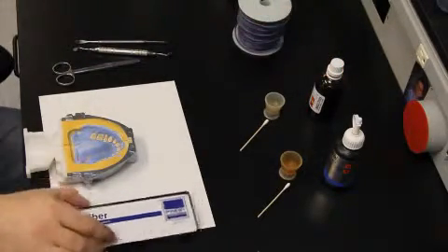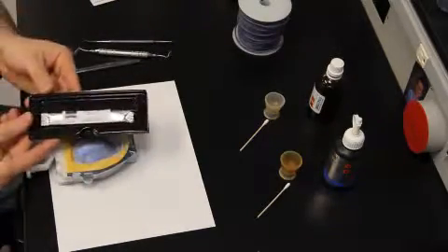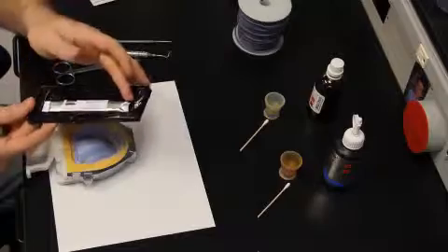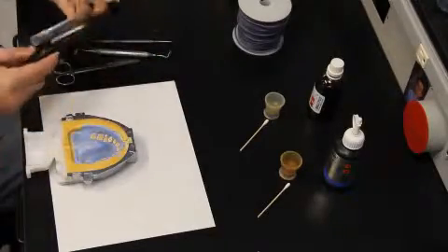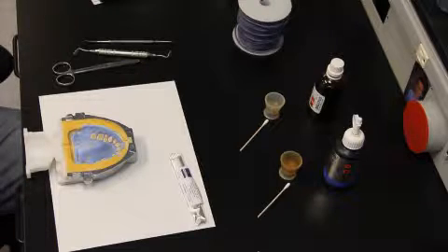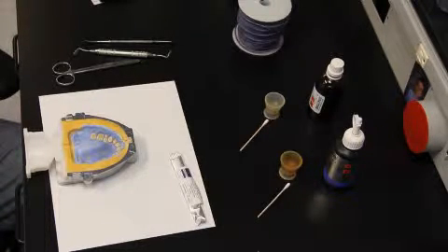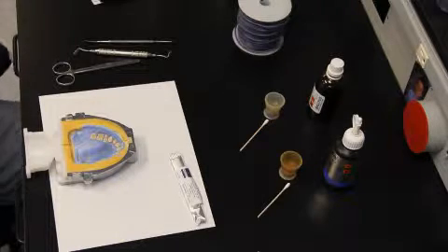So the first thing you're going to want to do is open your E-Fiber container. You're going to see it's going to come like this. E-Fiber comes in 2 different sizes. I use the thicker size. Open that up. Now it comes in that cellophane because it's light activated, so you do not want to open it until you're totally necessary.